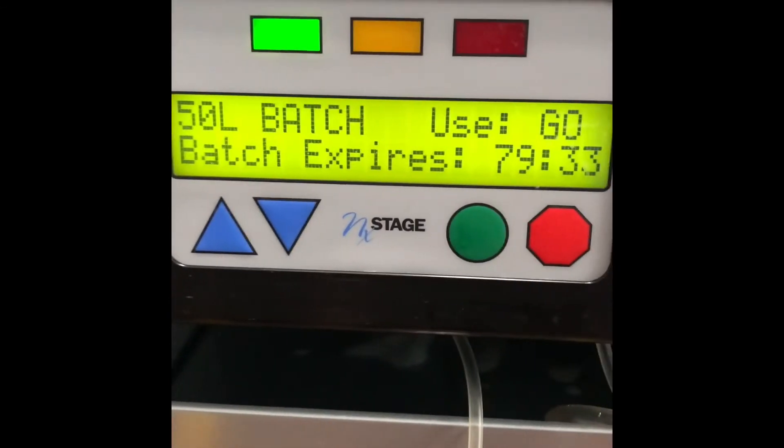I'll press the green button again. I have 79 hours and 33 minutes of this batch until it expires.